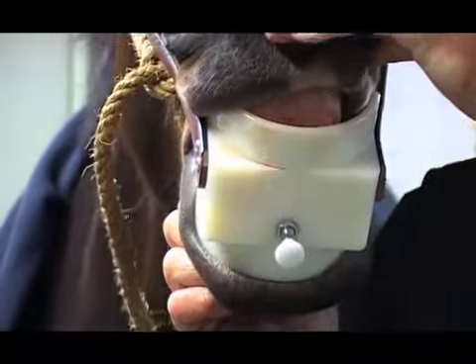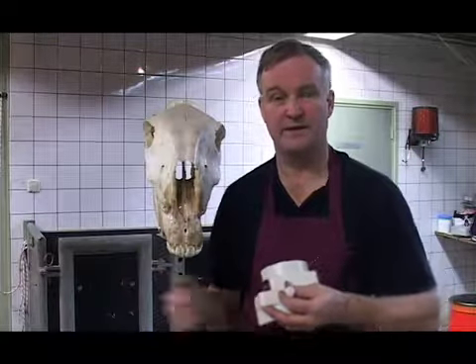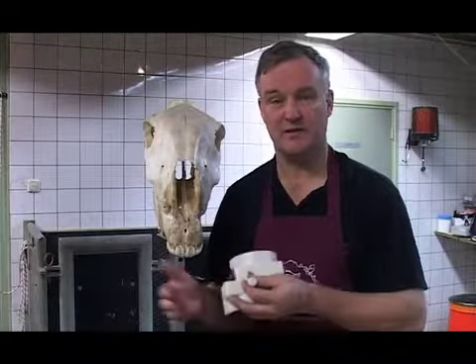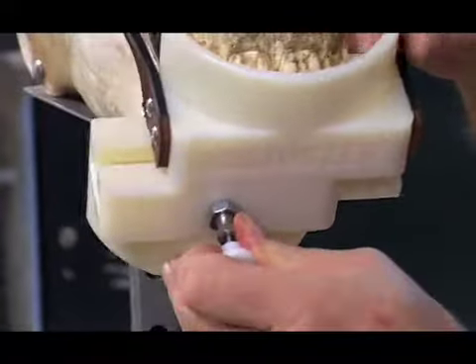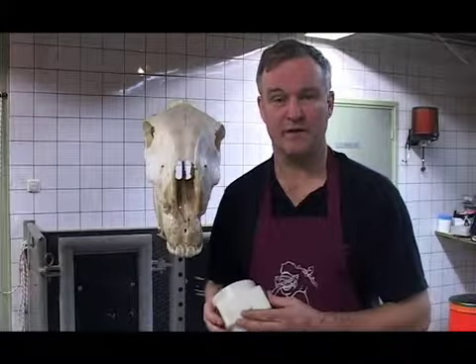In the past, you needed at least two people with ropes to put the mandibula and the maxilla in the offset position. Now you can do this with one technician.